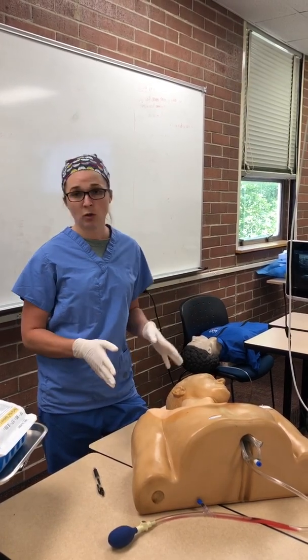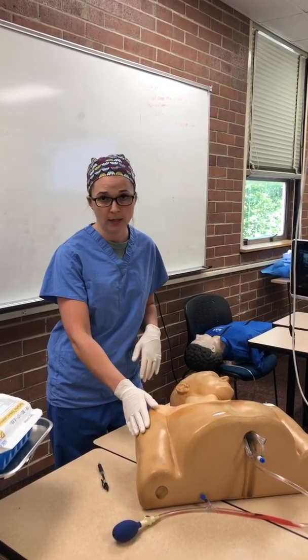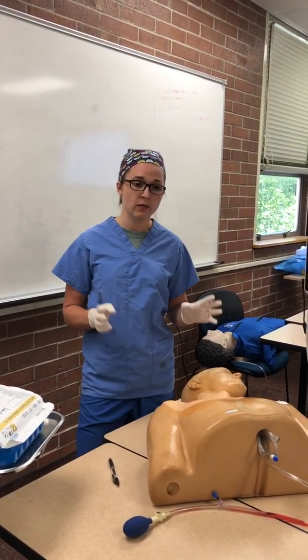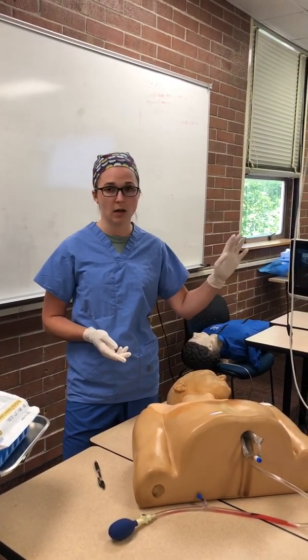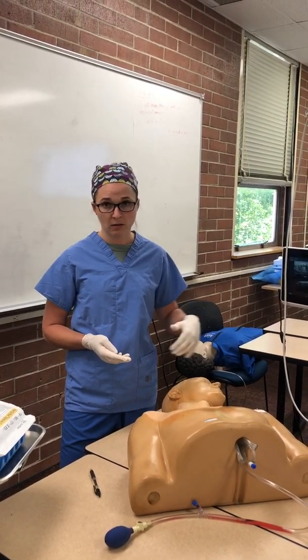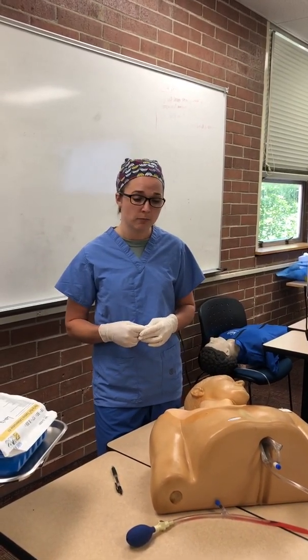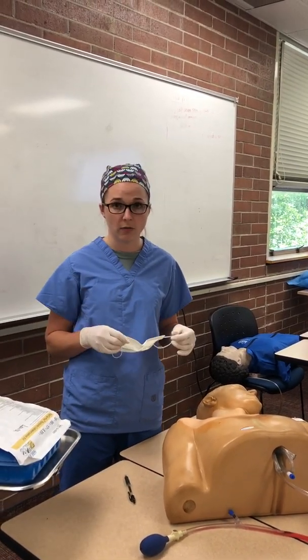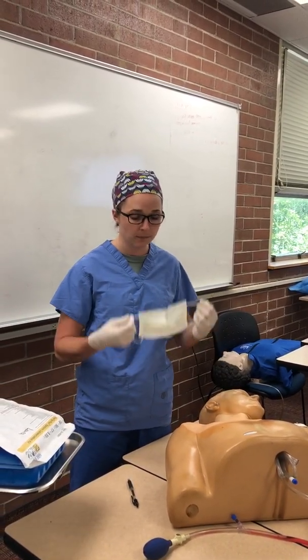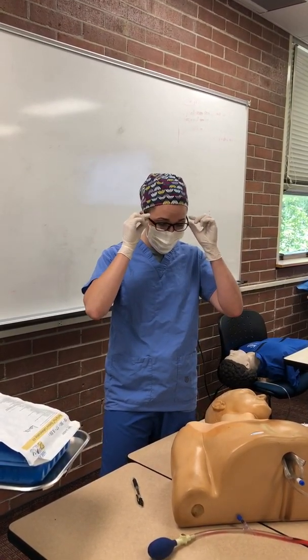Then next, going back, I'm going to do this after induction. So again, we've already confirmed his site and all of that. If he had been awake, I would put on a pulse ox, blood pressure, all of that, some supplemental oxygen, and consider giving him like 2 milligrams of Versed and possibly some fentanyl to get him more comfortable just beforehand. But again, this will all be post-induction, so he'll already have all of those monitors and be ventilated. So assuming we're back there, we'll go ahead and position him.